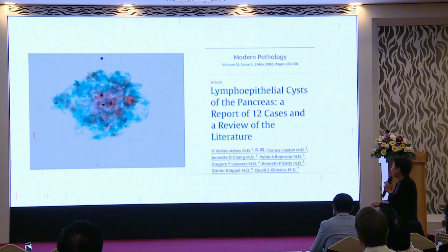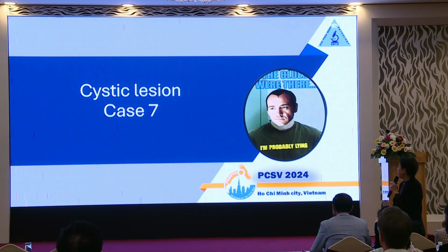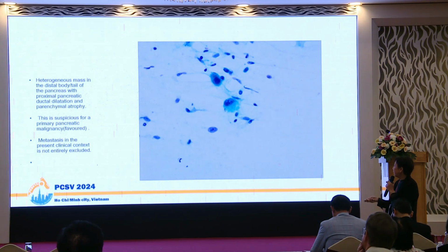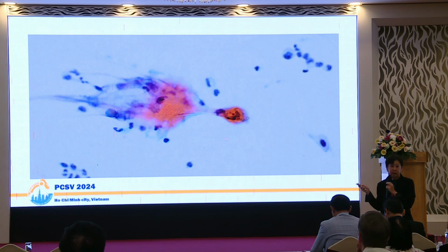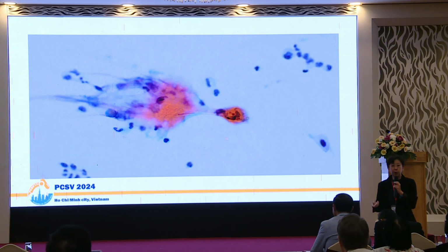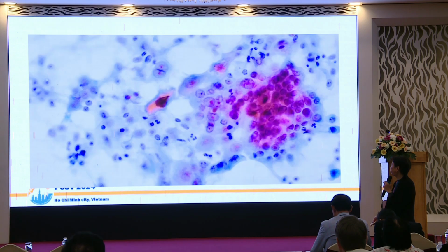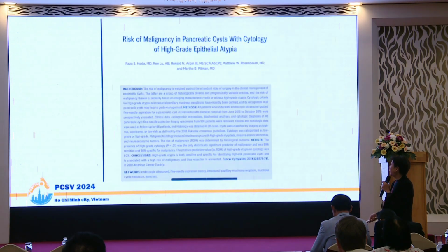Just as an aside, other cystic lesions, they've got epithelial cysts, and then, just to say that if you look, there are all the clues, but you may not trust the clues. So this is atypical squamous metaplasia. Sometimes you do see squamous metaplasia, then you have to think, is it a squamous cyst or is it a squamous cell carcinoma? Because squamous cell carcinomas tend to be cystic. So it was not a cyst. This was a squamous cell carcinoma.